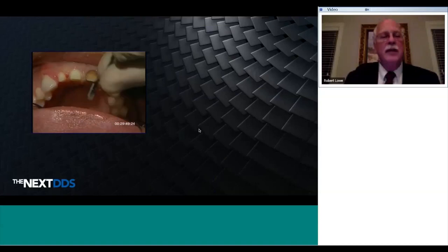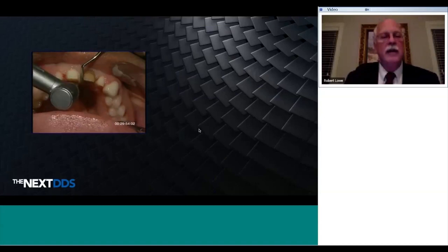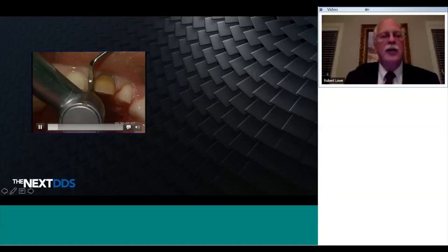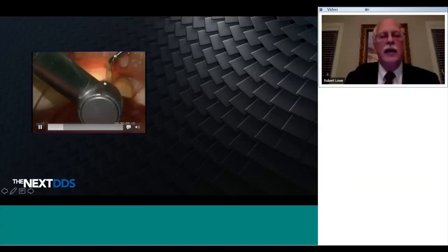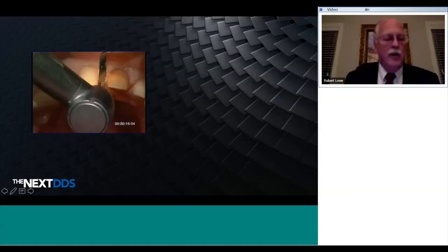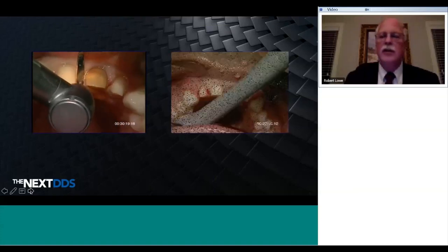This is something you'll never see in dental school, and dentists won't show you, but this is a nice little trick to make sure you've got a smooth margin with no little lip, because you may have a little enamel projection right here because the shape of the burr is rounded. You don't see that until you retract the tissue away and see that little lip, and that has to be removed. Technicians call that the J margin. That margin will break in the die and will cause you to have an open margin in your restoration.